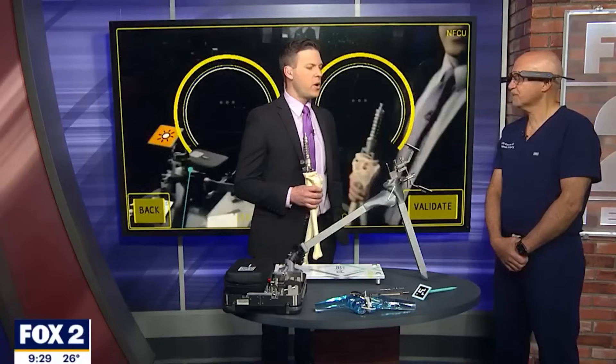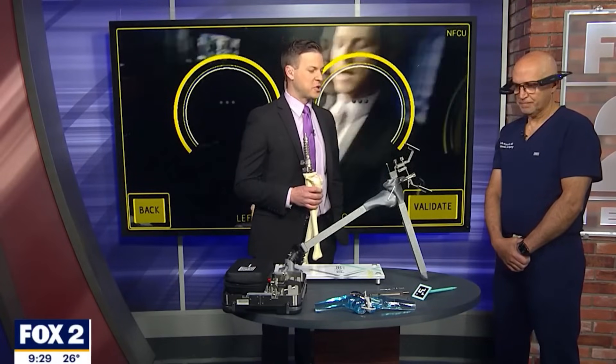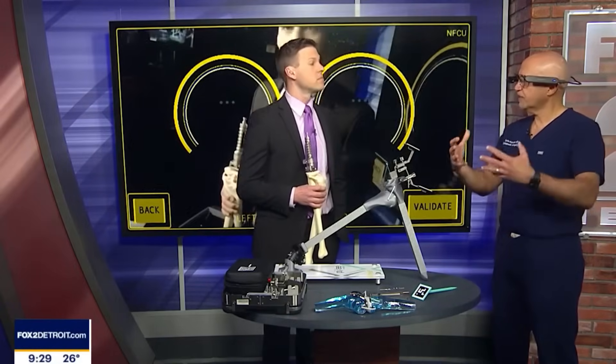Is this the future of surgery? Oh yeah, for sure, absolutely. It's already being used in spine — they get an image of the patient's spine, project that image onto the patient's bone. Remember, this is all just being projected, so it's less invasive. You're not having to drill into the bone or dig in there to find what's there. It's already being used in spine and in trauma, and this is just the beginning.